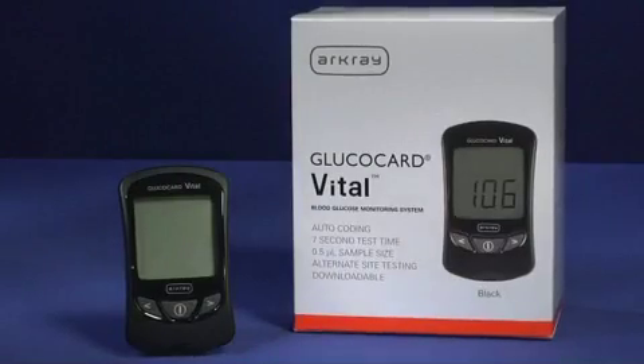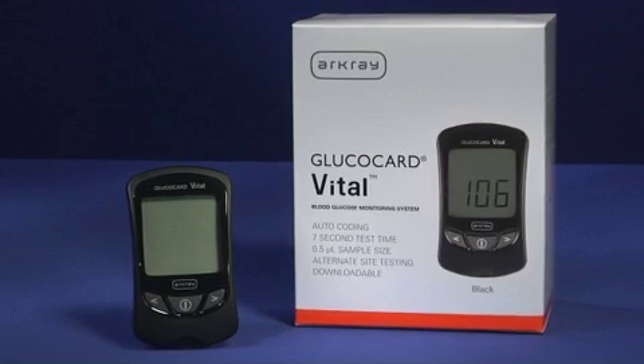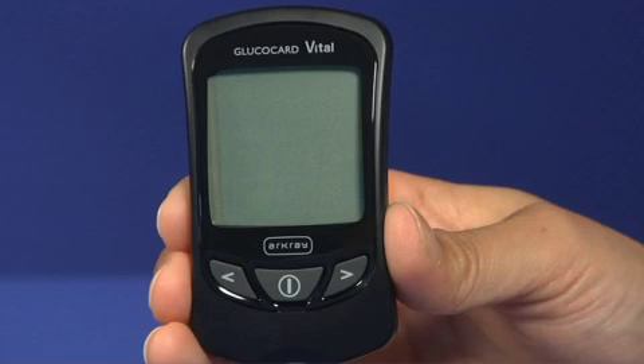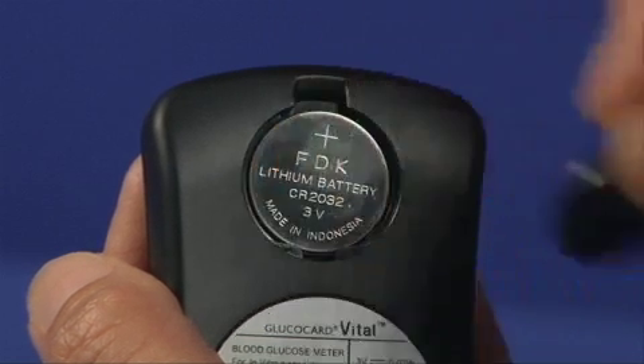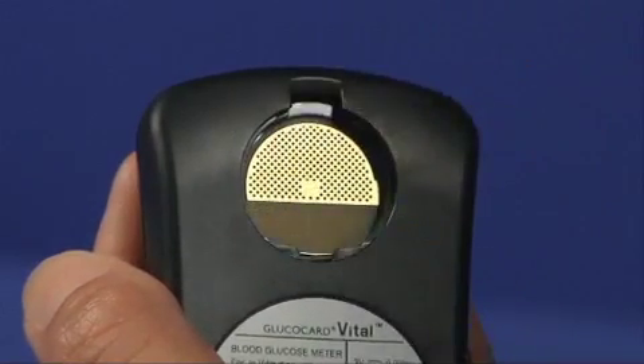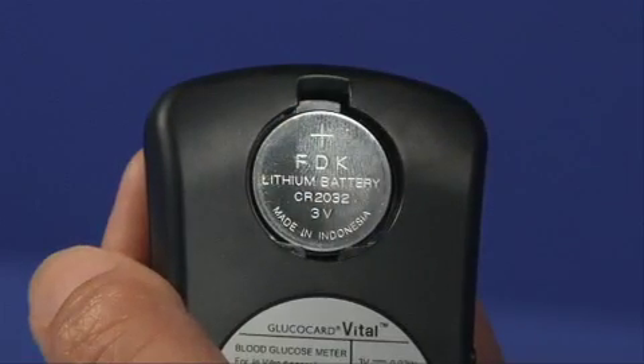Although your Glucocard Vital Meter comes with one 3-volt lithium battery already installed, you will need to change it from time to time. Make sure the meter is turned off. Remove the battery cover by pulling the cover tab up with your finger or fingernail. Remove the old battery and dispose. Insert a new 3-volt lithium battery with the writing facing up and replace the battery cover.